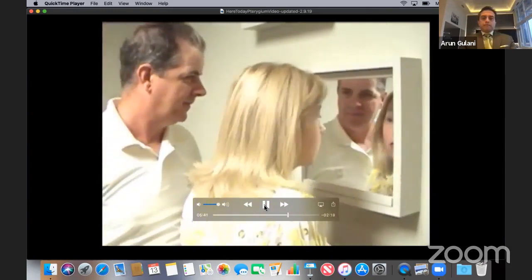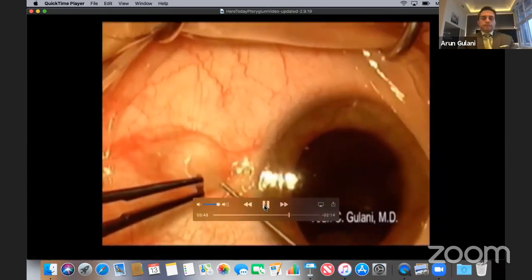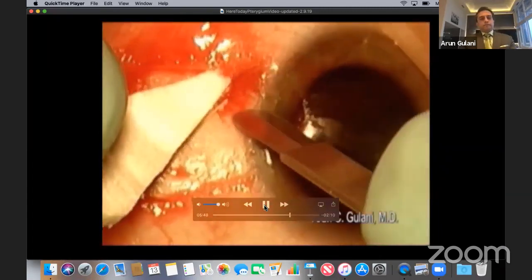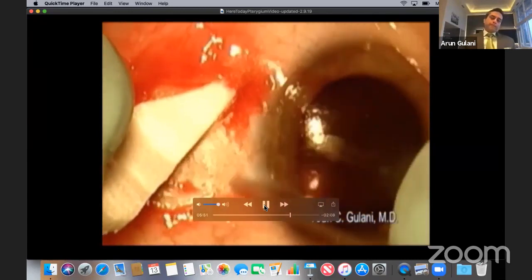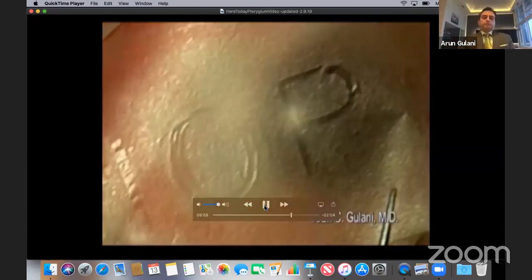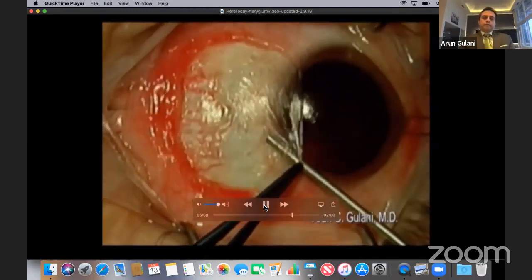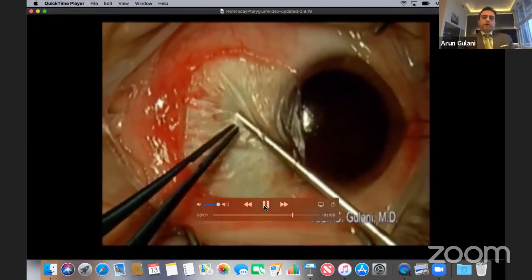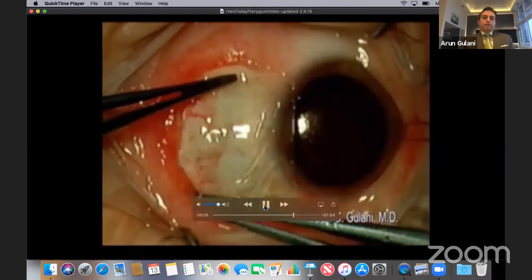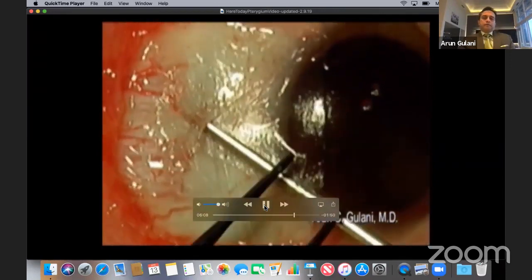All gone. In case of pinguecula, intralesional anesthesia, once again trace the pinguecula down to its roots. Blade to smoothen the limbus and episclera. Clean this area, prepare it for the amniotic graft that is received here. Placed into position. First component of the tissue glue, again delivered very subamniotically, controlled, very minimal glue. Sweep it into position, squeezing the amniotic graft simultaneously. Second component of the tissue glue, again subamniotic delivery.